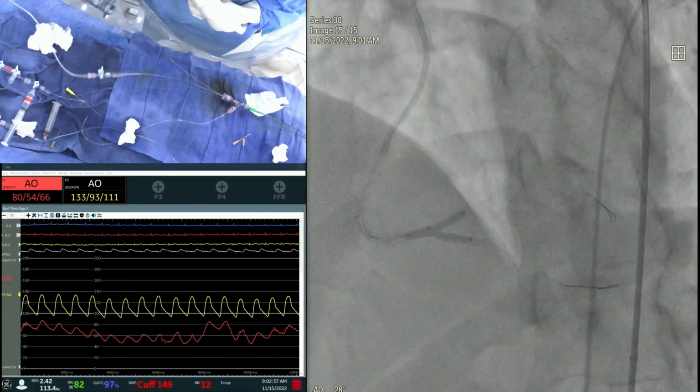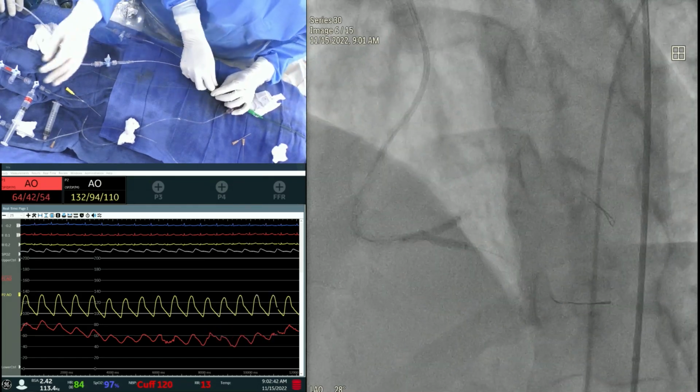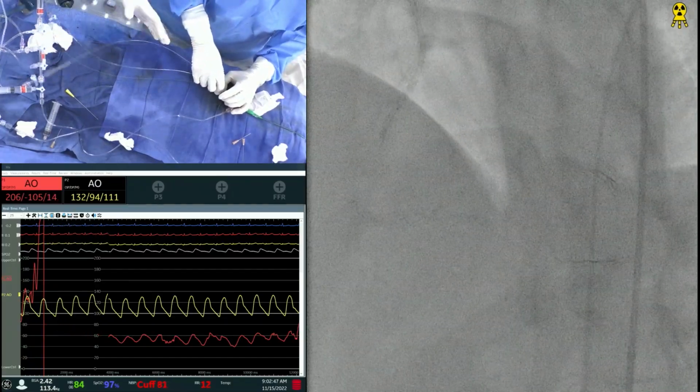Okay, down. Okay, good, right? Yeah. We're done. Very good. Take a picture. You'll do remaining mock. Nothing. No, just let me take a picture now. I'm taking everything out. Yeah, good.